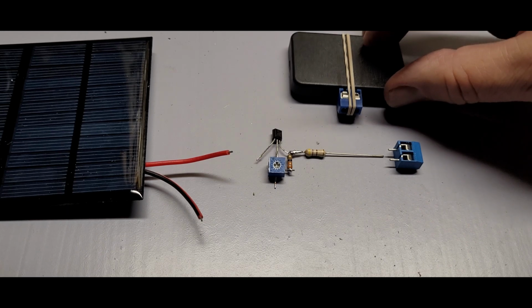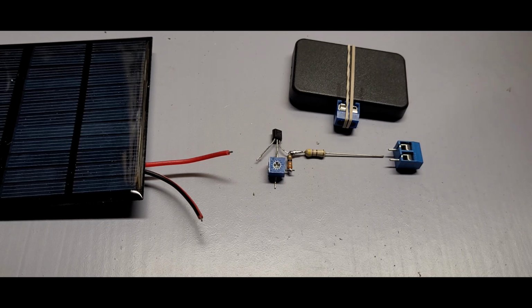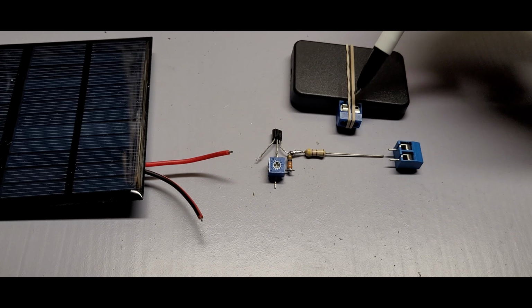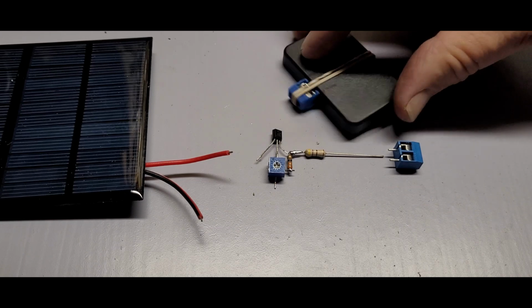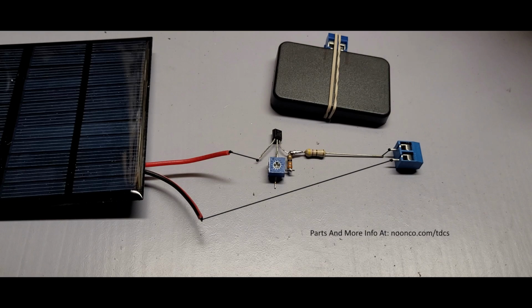I'm going to go ahead and mount all that inside of this little plastic case just for slickness. You actually could just glue it in place or leave it like that. It really wouldn't matter. And so I've got this glued and rubber banded to dry, and we'll mount this to the back of the solar panel, and we'll mount our circuit inside, and you'll have a beautiful tDCS that ought to run for just about ever with a solar panel.